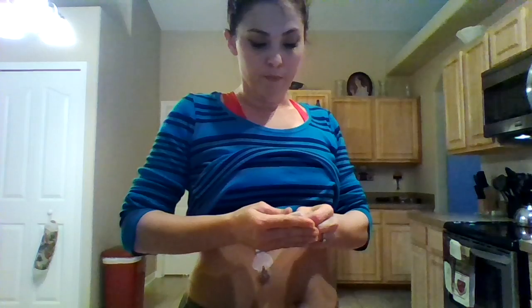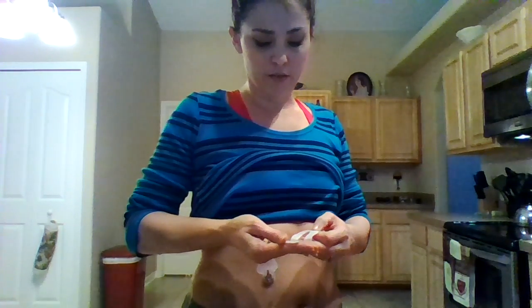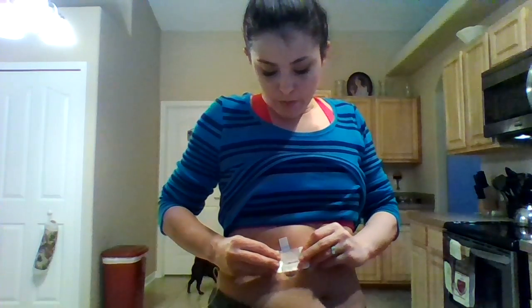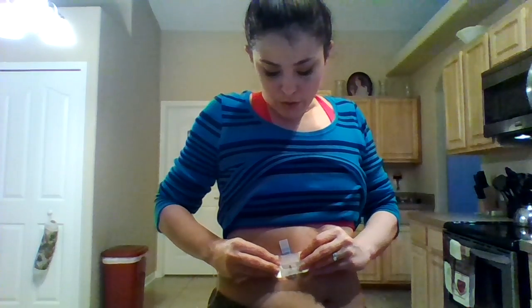Now I also use a double taping method, and this is what my pump trainer taught me. I honestly don't think I would do it any other way because there's no way this thing would last 6 days if I didn't. And these are meant to last 6 days. I change it out every 6 days. So this is basically some kind of clear medical tape, but if you ask me, it's super duper clear medical tape, because I have to use some special stuff called Unisolve to get it off my skin because it really hurts.